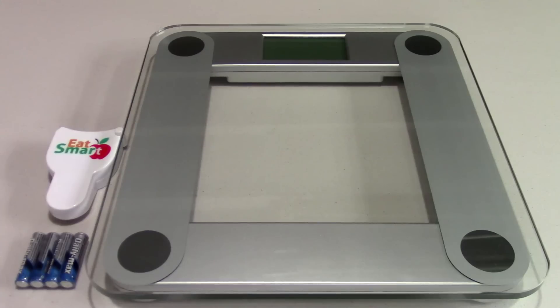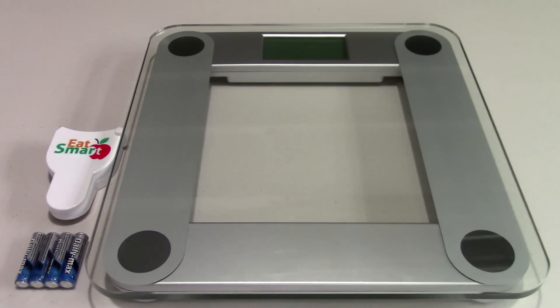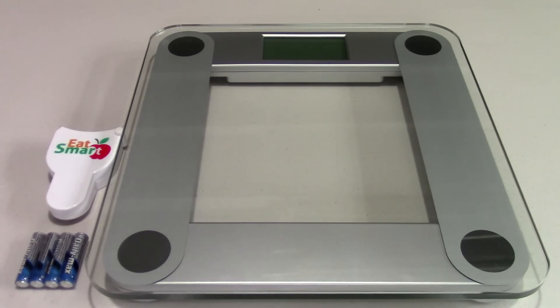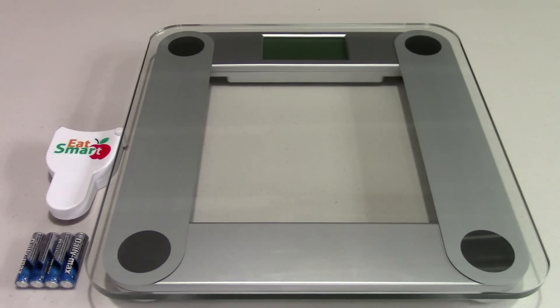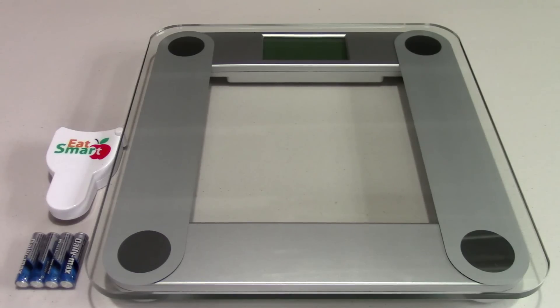And it's got step-on technology as they call it, whereas most scales of this type you have to step on, step off real quick to let it know that you're going to be trying to get a weight measurement. This one here, you just step on and it'll weigh you right up.